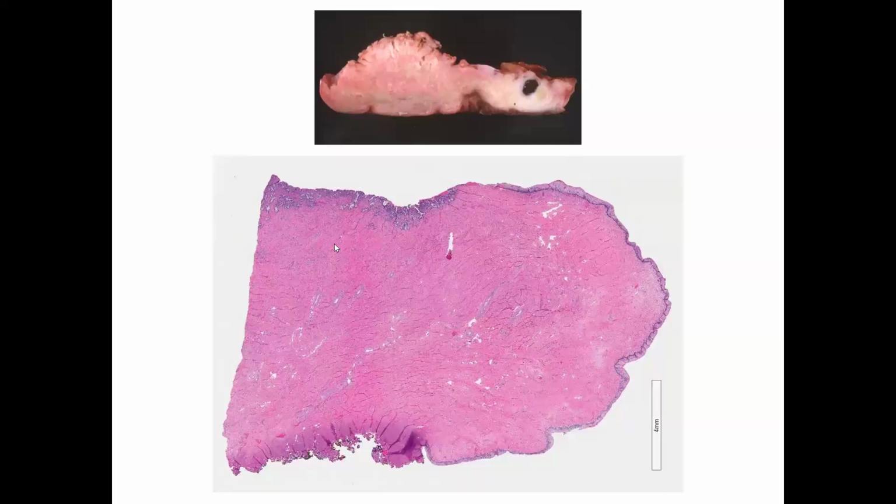So this is how the anterior section should look like under the microscope. You get the ectocervical margin. So there's a tip of vagina here, and then you have the ectocervical epithelium, and here's the transformation zone, and here's the endocervical canal. So this part corresponds to this part in the gross picture.